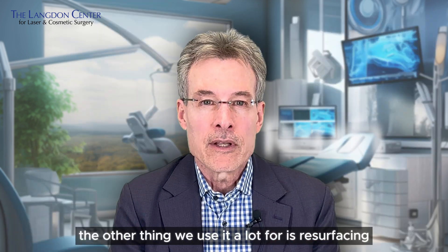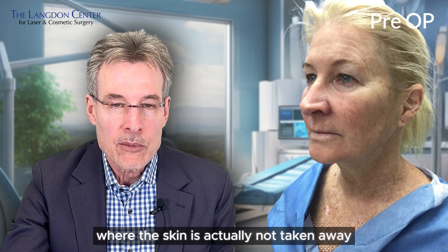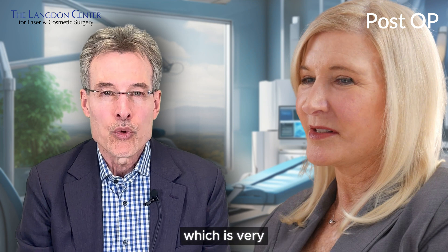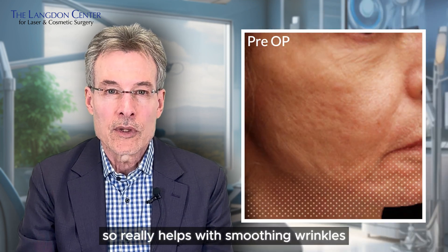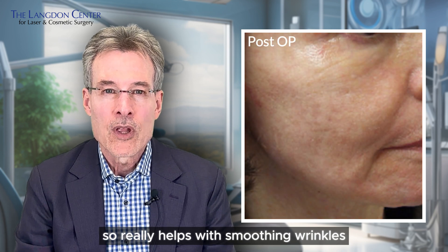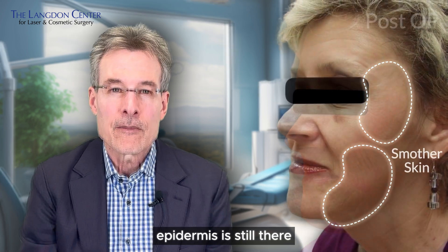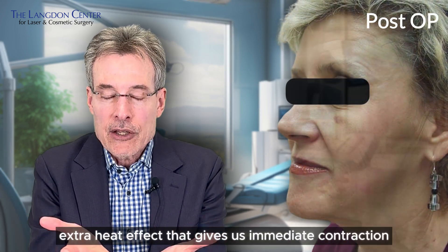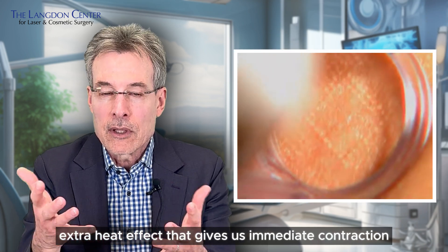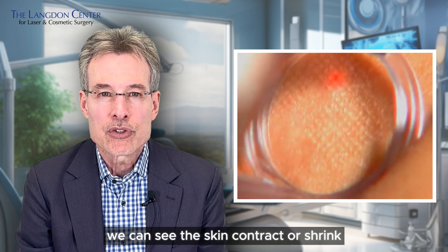The other thing we use it a lot for is resurfacing, where the skin is actually not taken away. There's a thermal effect from the laser that is very effective at causing contraction of the skin, which really helps with smoothing wrinkles and also greatly speeds up recovery because the epidermis is still there. It's unique to the CO2 laser — it's the only one with that extra heat effect that gives us immediate contraction. We can literally see the skin contract or shrink right in real time on the face.